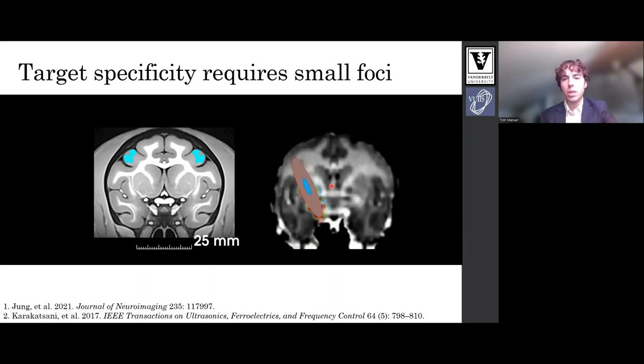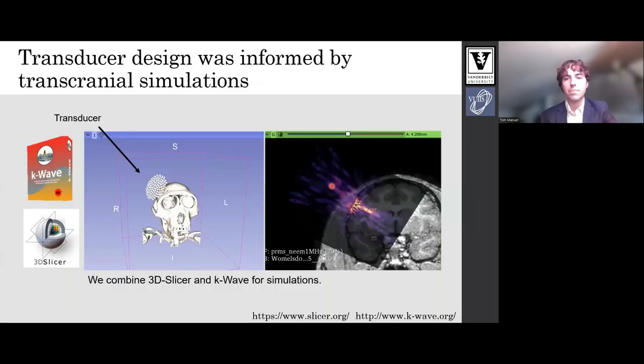So we designed a transducer optimized for this at cortical targets. Our transducer design was informed by transcranial simulations. We used a combination of K-wave and 3D Slicer. The left shows how we placed transducers around skulls using 3D Slicer. The right shows a K-wave simulation result overlaid on an MRI.